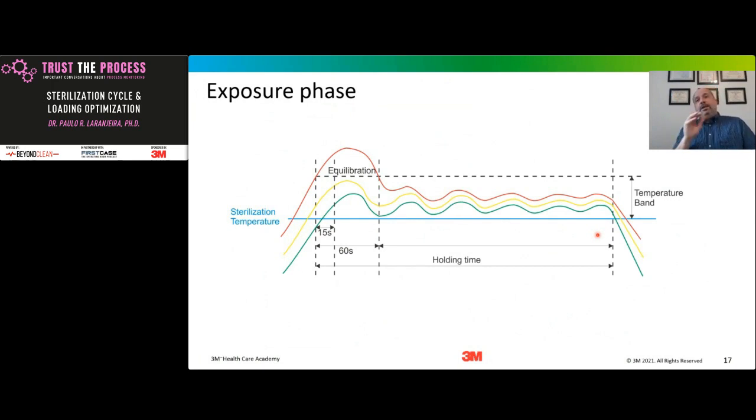So here we are going to have the presence of latent heat. This is the only phase of the sterilizer that latent heat is present. That's why we cannot take into consideration, especially when we are sterilizing medical devices in hospital, the temperature on the conditioning phase or the drying phase. Those temperatures, they do not guarantee latent heat. And what sterilizes our load, what inactivates the spores is the latent heat. So the latent heat is going to occur when we have the temperature variation.